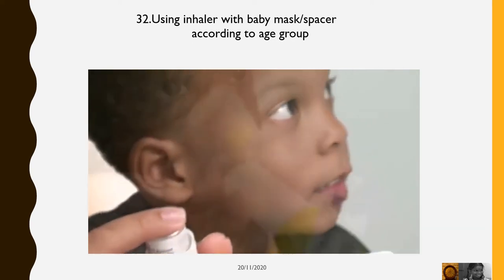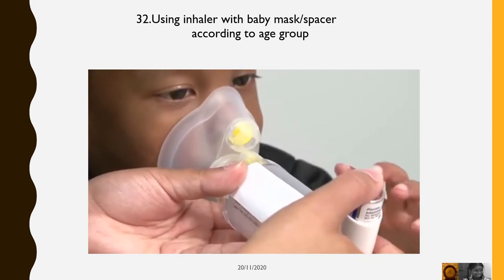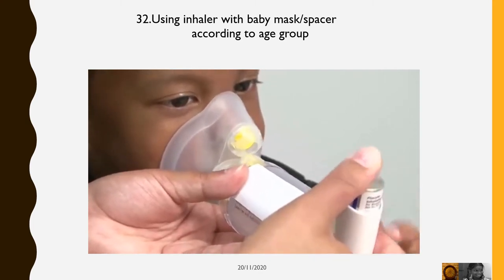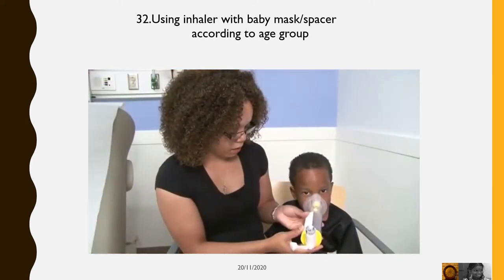Shake the inhaler well for 10 seconds. Place mask tightly over nose and mouth, push down on the inhaler once. Now the medicine is inside the spacer. Breathe in and out six times through the mask.